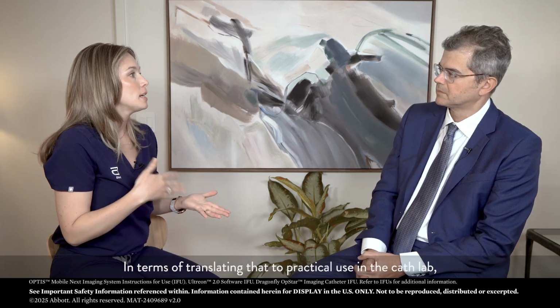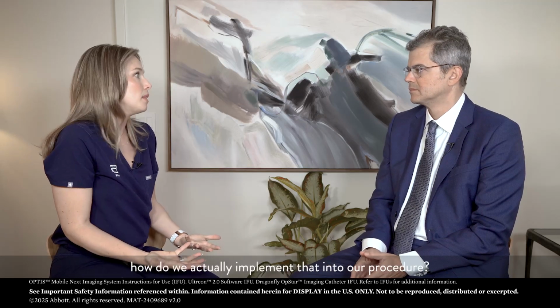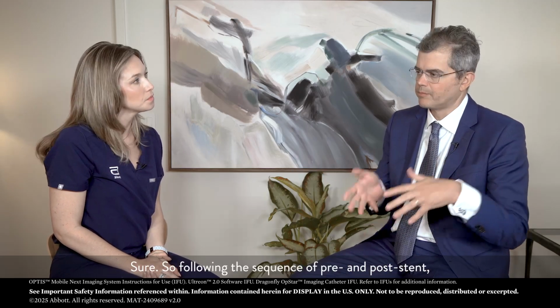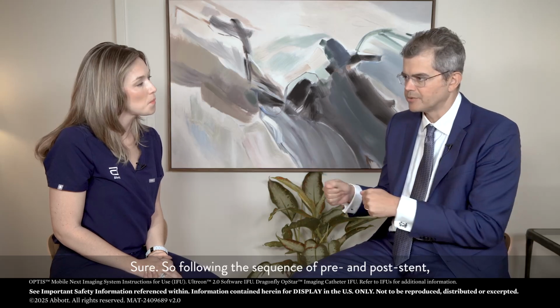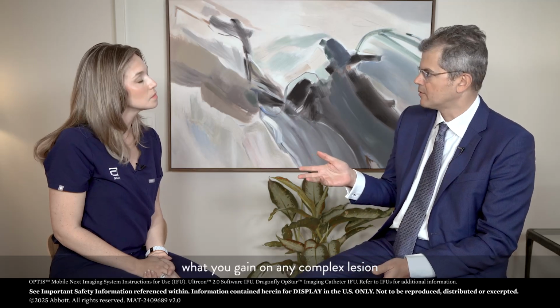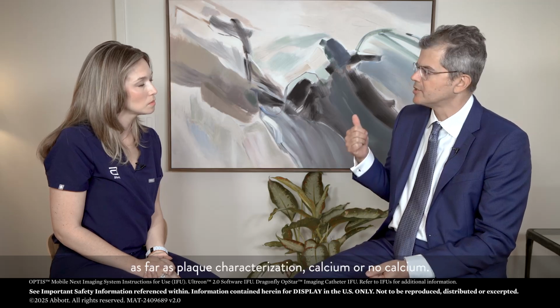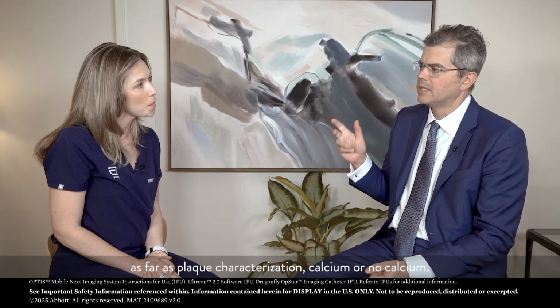In terms of translating that to practical use in the cath lab, how do we actually implement that into our procedure? Sure. Following the sequence of pre and post stent, on the pre-stent you gain what you gain on any complex lesion as far as plaque characterization, calcium, no calcium.